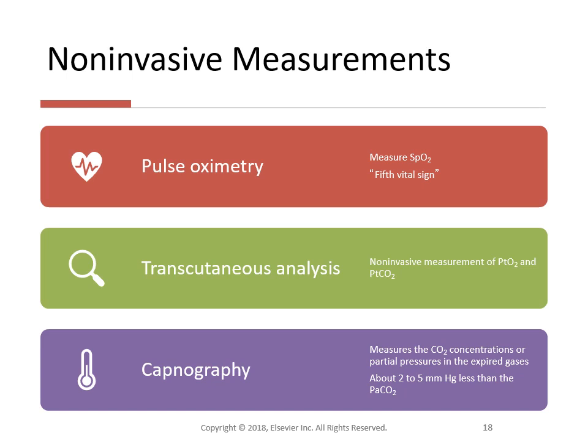VQ imbalances can alter differences between PaCO2 and PETCO2. These imbalances are common in patients with respiratory disorders. Therefore, we normally focus on trending of the end tidal CO2 levels when using capnography for continuous monitoring.